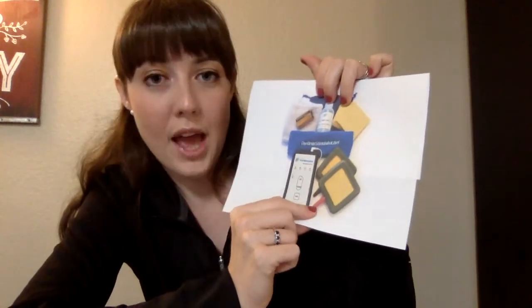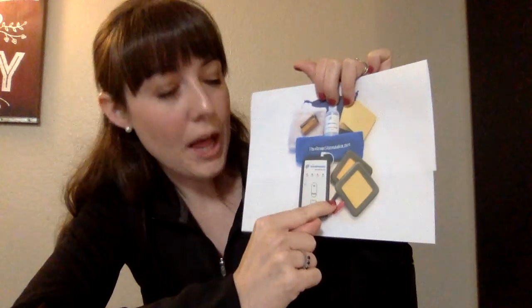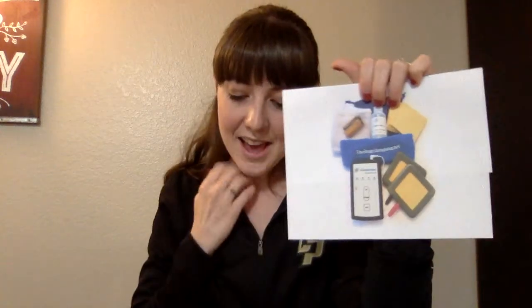So there's a red and a black. The red stands for anode, which is a positive stimulation, and the black is a cathode, which is a negative stimulation. And it's important to plug those into the correct port. Otherwise, you could get opposite results for your client, which you would not want.